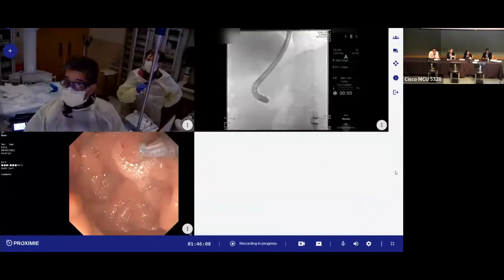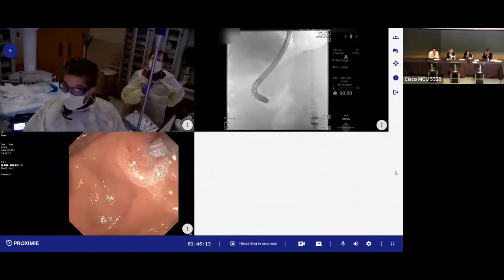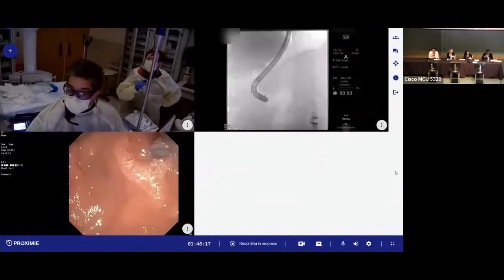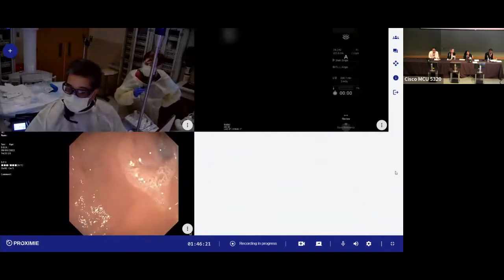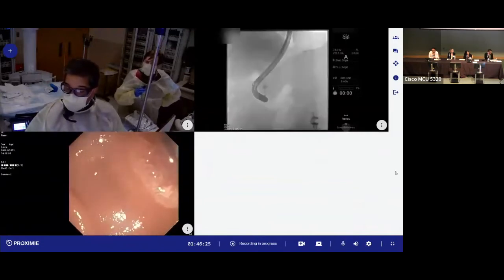Distal bile duct, because there are some stones in the duct. So this is where I give a little injection of contrast. Kiri's going to give a little bit of contrast under fluoro. Go ahead. I'm looking for side branches. That's the first thing I'm looking for. If I get the bile duct, great, but I want to be sure I'm not in side branches. Keep injecting here. I don't see side branches.